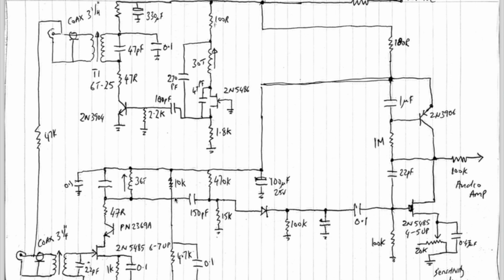The demodulated signal then comes through here. You've got a diode, that's a 1N4148, again, sorry for not putting that in, just a bog standard signal diode. And then your signal, the demodulated audio, is amplified through this FET. I think what this transistor does here is delay the switching on. Not quite sure of the purpose of that. It would probably work without that, but if anybody thinks otherwise, just let us know in the comments. And then we go to an audio amplifier, which hopefully I can show on this next picture.